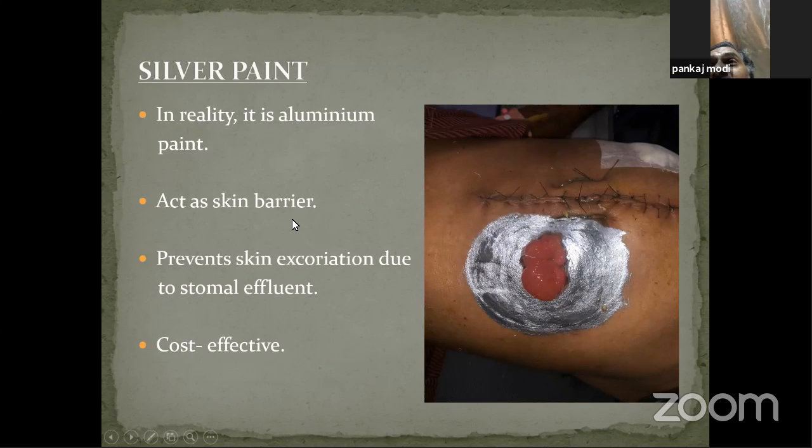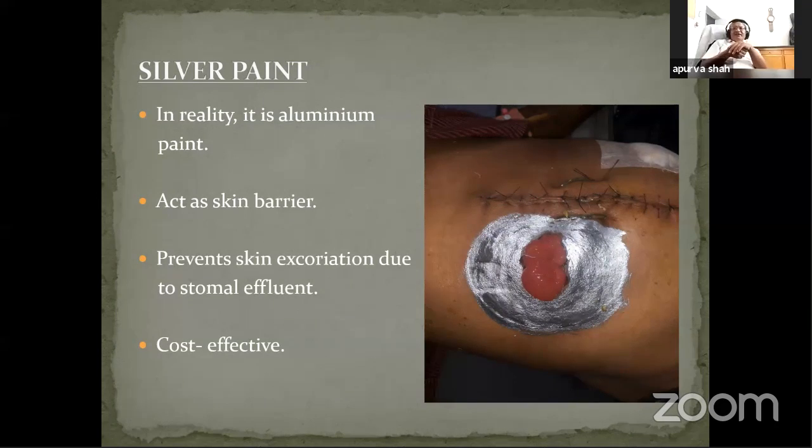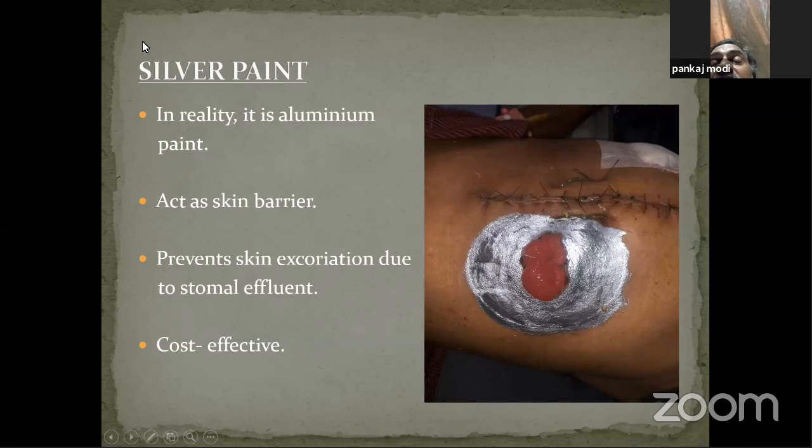Amrit, again, I would like to differ. Apurva, would you like to say something or should I? The point is that this is not for a stoma. Understand this point. We were never using it for a stoma. The only time when we used to use it was if there was a perforation near the base of the stoma, and the contents were coming by the side of the stoma and the end was not coming, then there is a role for this barrier. Otherwise, applying the stoma appliance can be done in those cases. But particularly when there is a site like a fecal fistula, then. And normally we used it in a case of enterocutaneous fistula, early-time proximal fistulas, as a skin protection.